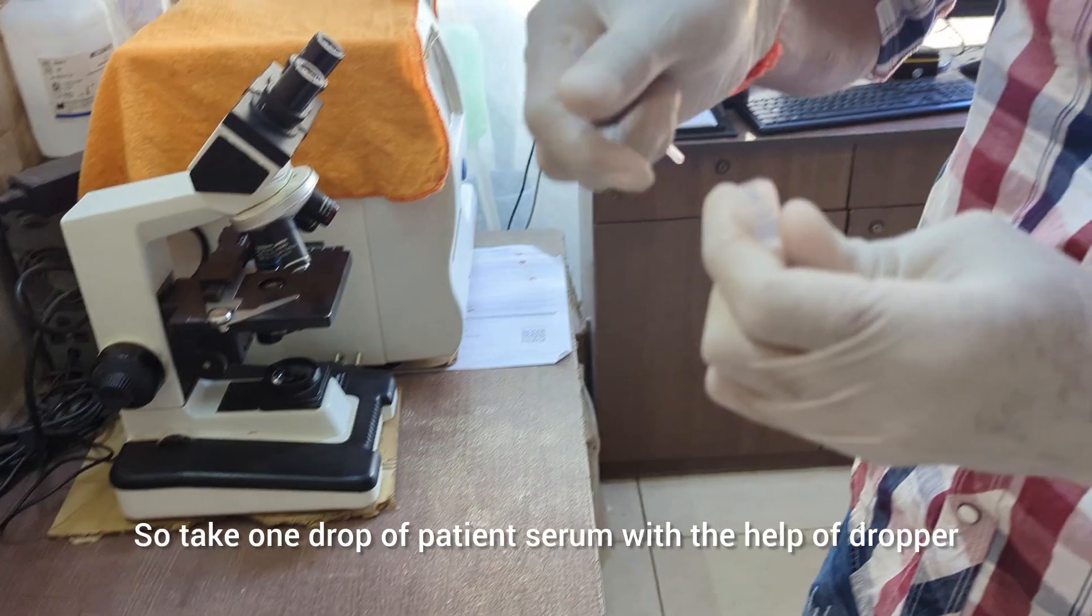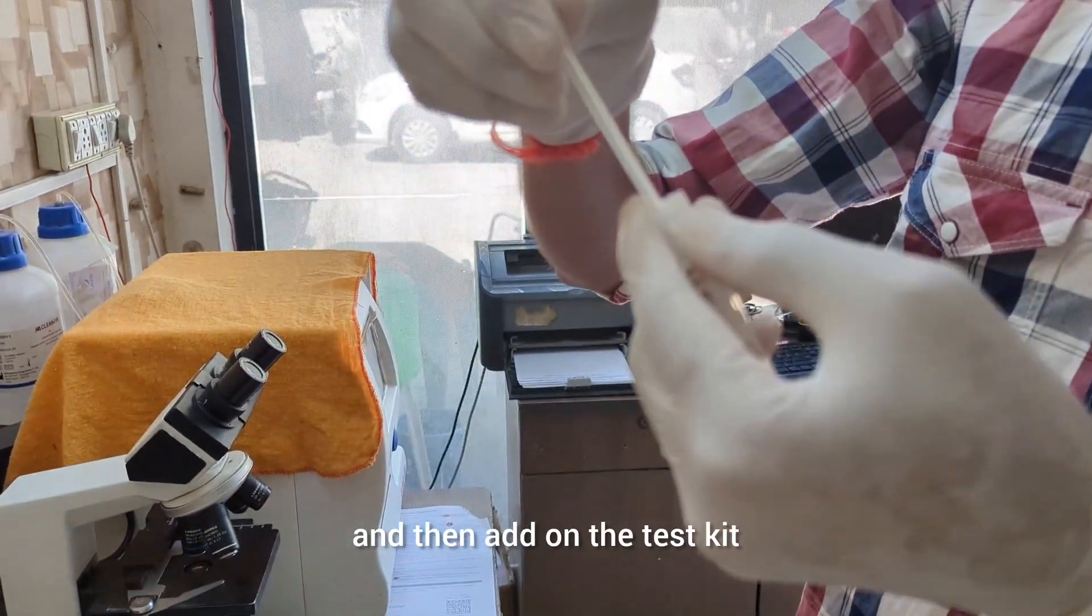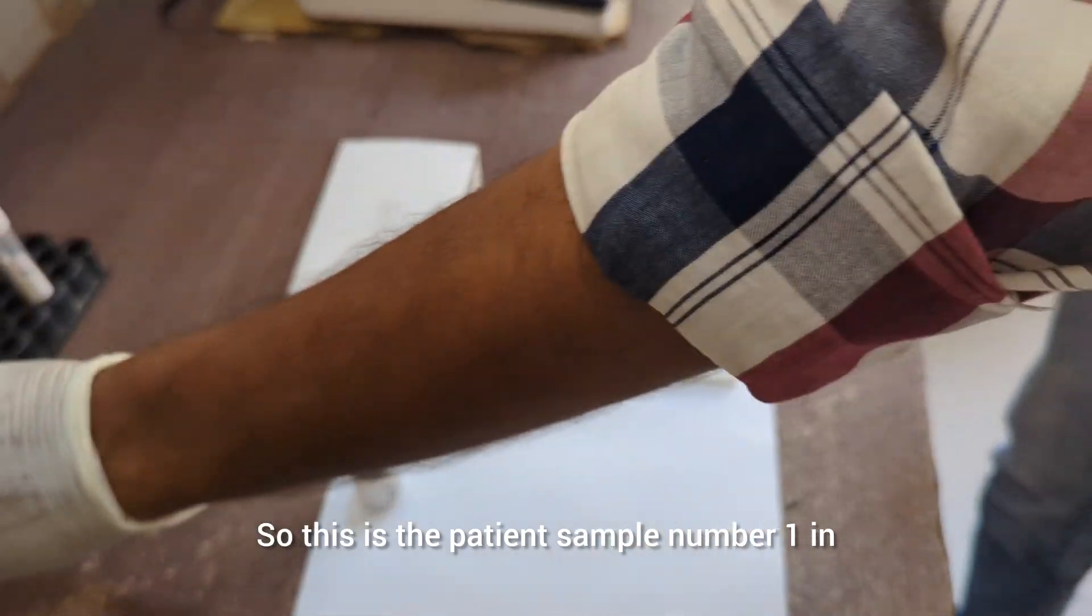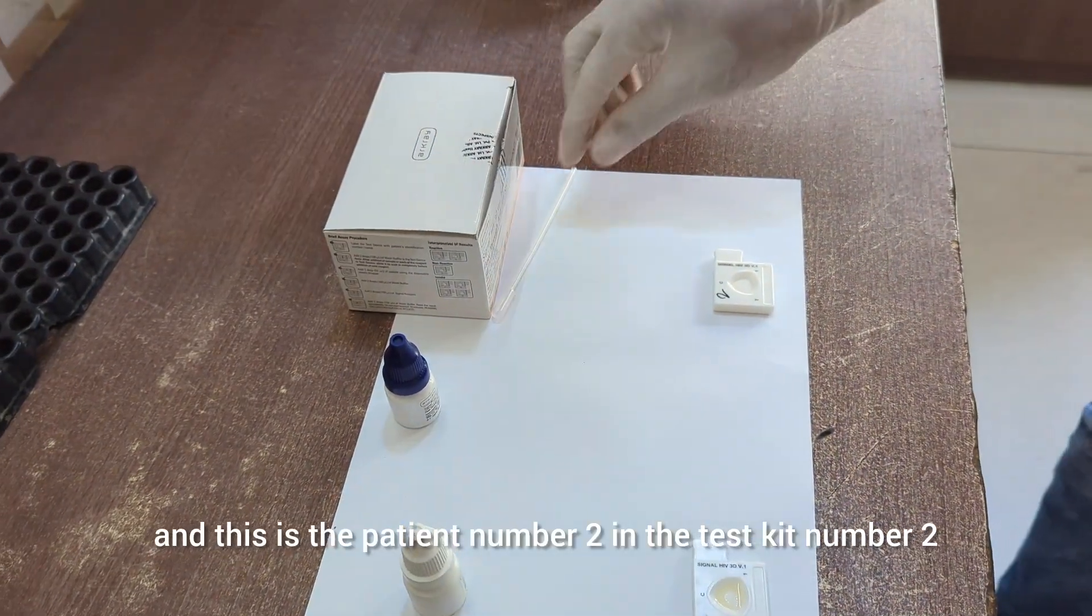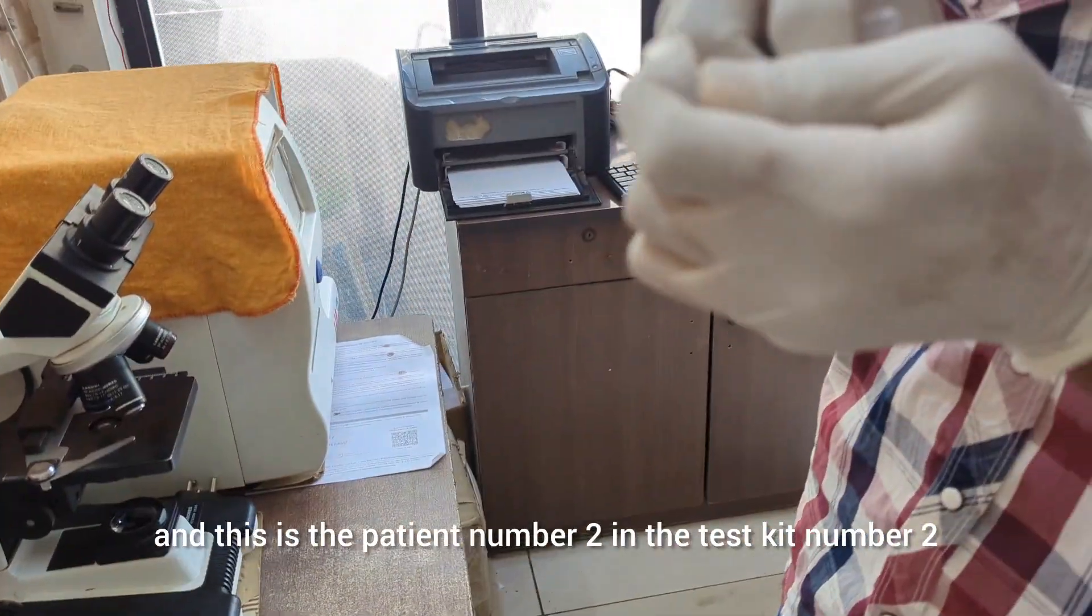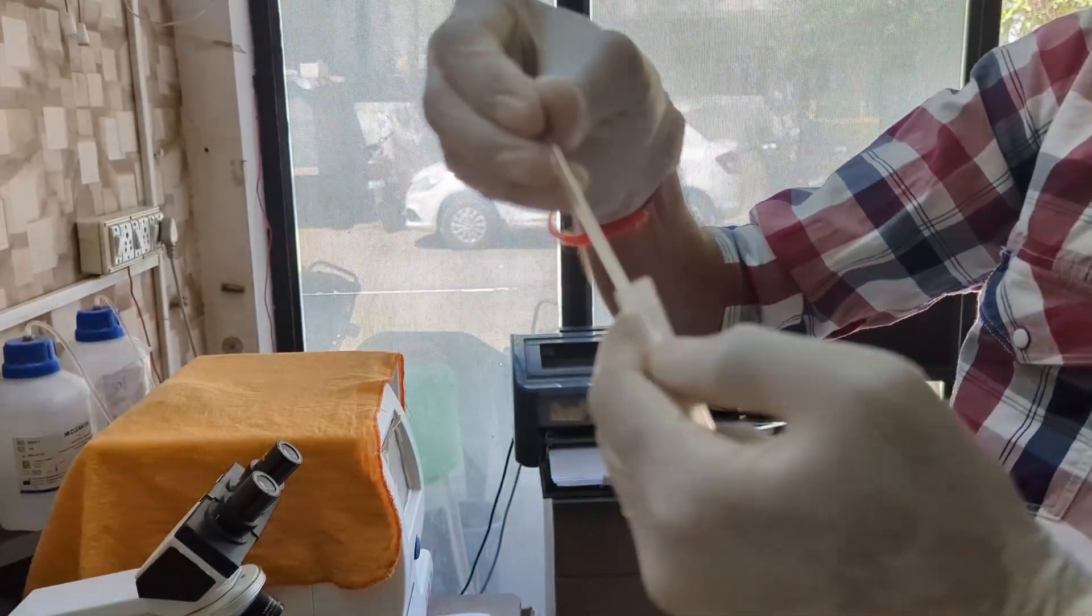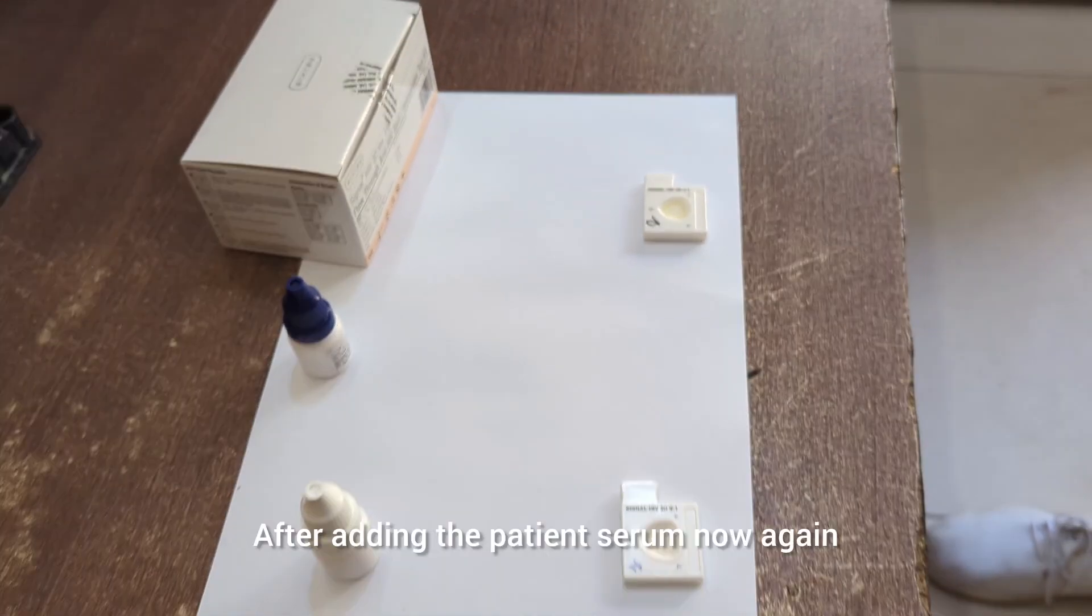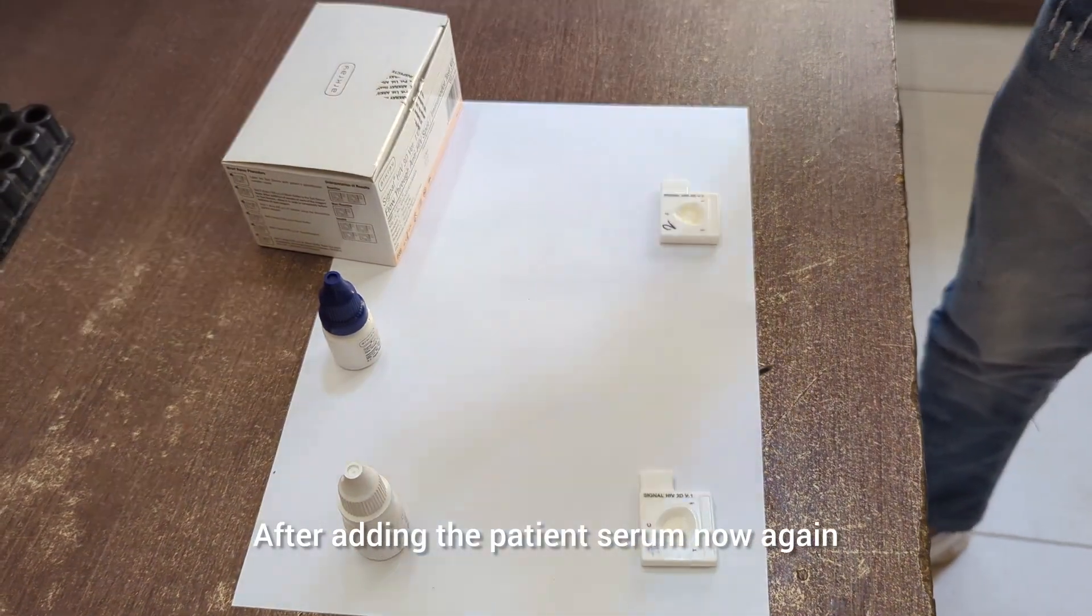After adding the wash buffer, you have to add patient serum. Take one drop of patient serum with the help of a dropper and then add it on the test kit. This is patient sample number one in test kit number one, and this is patient number two in test kit number two.